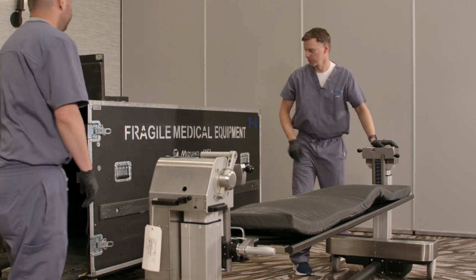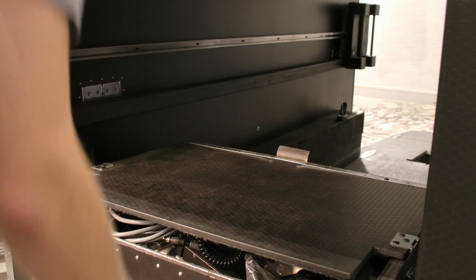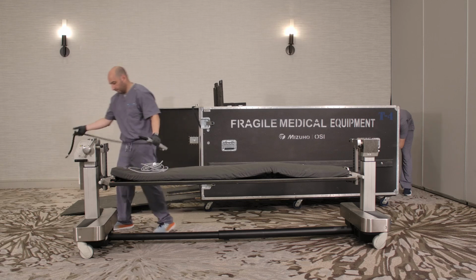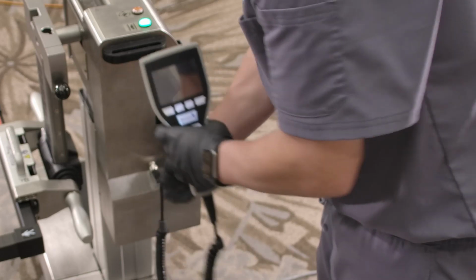After the tabletop is attached, head to the rear of the crate to grab the accessories. Find the power cord and the hand pendant in the lower bin of the rear of the crate. Plug the hand pendant cord into the side port of the table and hang the hand pendant on the side.